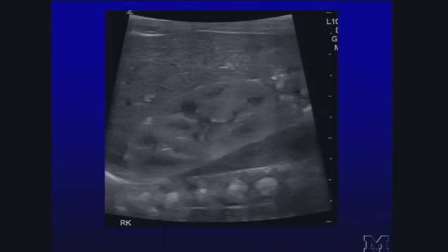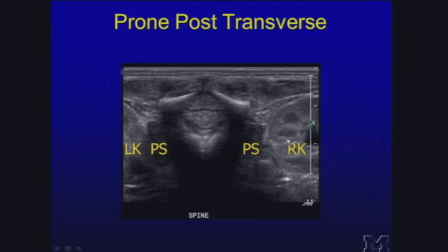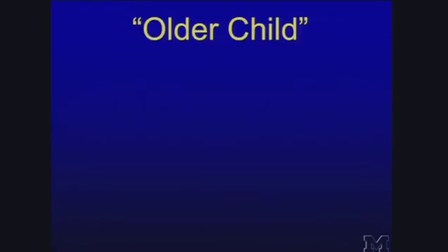Now, this is in a plane that you're not going to really use for the spinal canal sonography, but you can see the top of the psoas here. You see this is actually a renal shot, and that should be L1. But you can see it actually in the way that we will image for the spinal canal. Notice this psoas here, and this would be the spinal canal here. So if you flip this picture upside down, this is where we're going to be seeing. So here, in this case, is the right kidney, the left kidney, the psoas. This is the spinal canal. These are roots of the cauda equina. So what I do is I find a picture where the psoas is quite obvious, and then I just march superiorly towards the head until you just barely see it, and then notice what's going on in the spinal canal, and then call that L1, and then just come back down from there, and you can see where you are. So it's another way that can help.